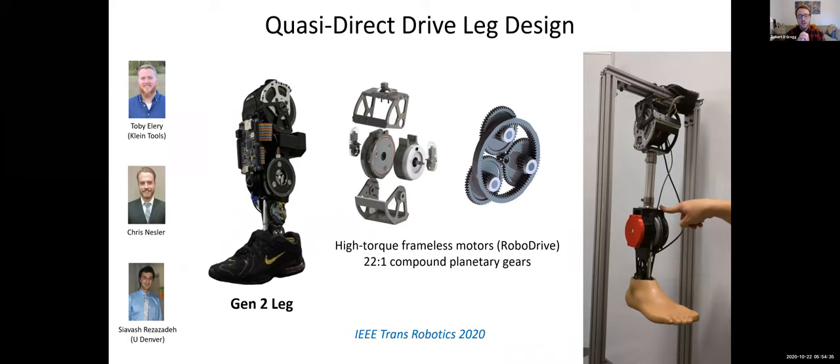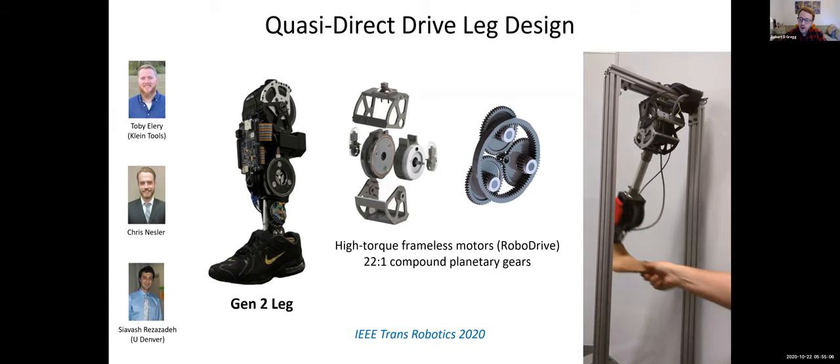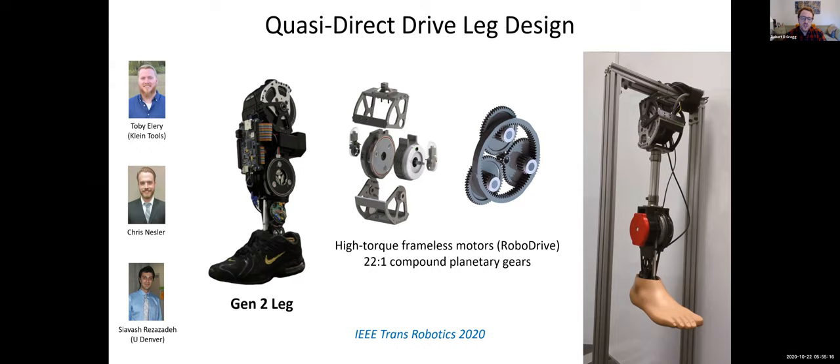This is our leg design. We chose a RoboDrive frameless motor, which can deliver a large amount of torque — about eight newton-meters — and a 22-to-1 compound planetary gear set mated to the motor. This allows very back drivable motion, as seen in the video where the researcher is able to push it with their finger and gravity pulls the leg down when it is released at an angle, demonstrating back drivability when the power is entirely off. If you're interested in other specifications — like peak torque, which is around 180 newton-meters, and back drag torque, which is around three newton-meters, as well as power consumption — please see our 2020 Transactions on Robotics paper.